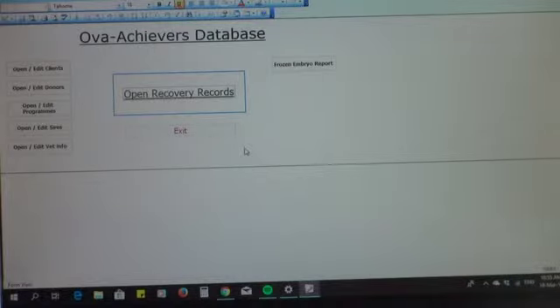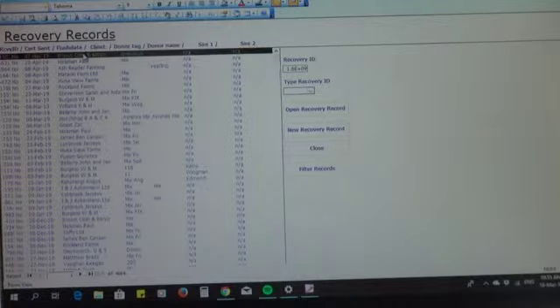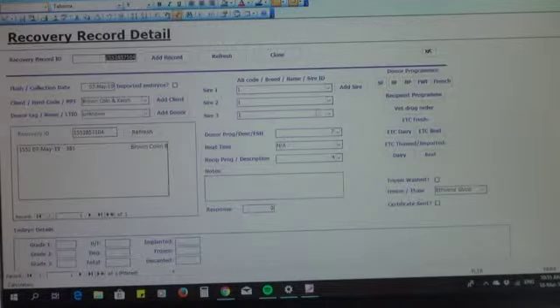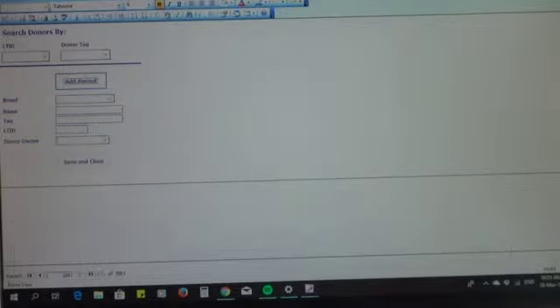Okay, so here's the second part of the exercise. Today it's the 7th of May, we're at Colin Brown's and we've flushed his donor. So we've got some more information we can get. He tells us which cow it is. It's a new cow we haven't done before.